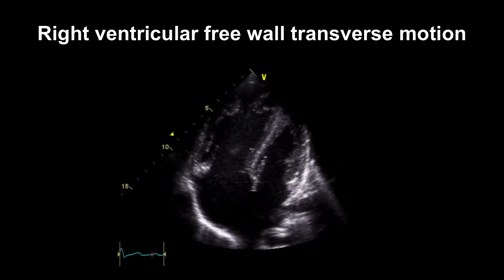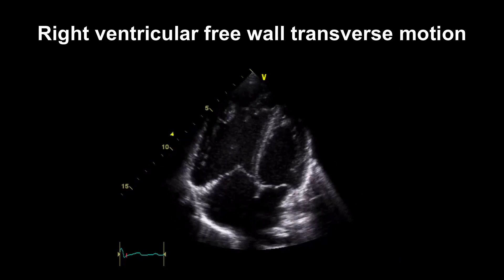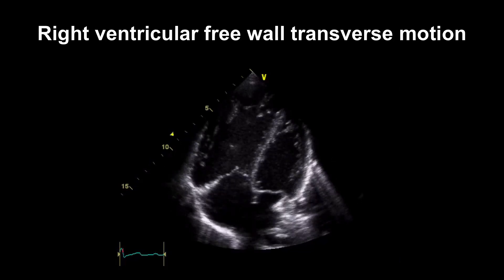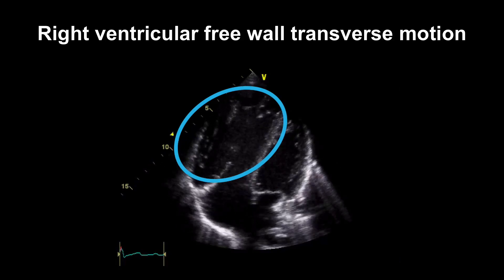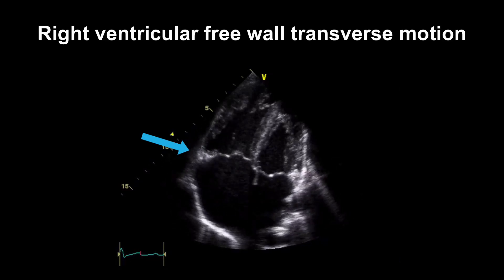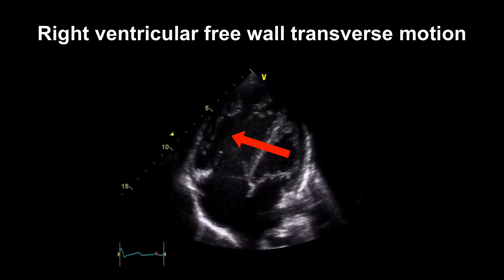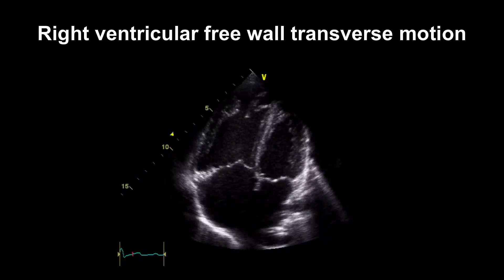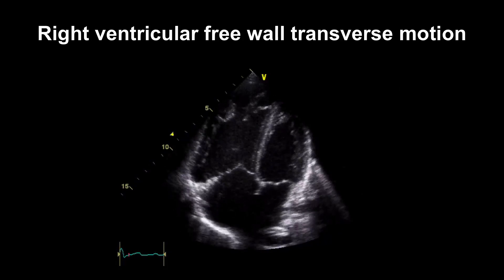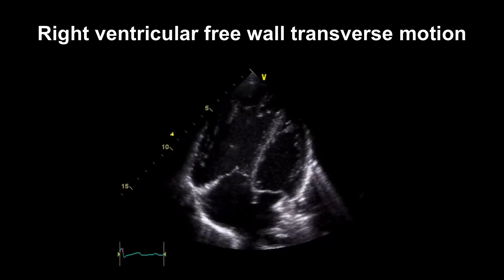Now I want to think about the transverse function of the right ventricle. This is a modified four-chamber view adjusted slightly to focus on the right ventricle. You can see we've got a dilated RV, and whilst the longitudinal motion looks preserved — moving up and down quite nicely — the free wall here isn't moving inwards in systole. We would report this ventricle as dilated with preserved longitudinal function but abnormal transverse right ventricular function, indicating some degree of RV systolic impairment.